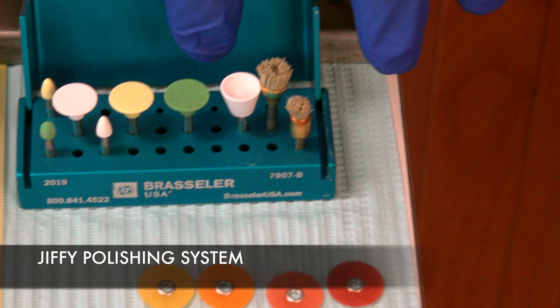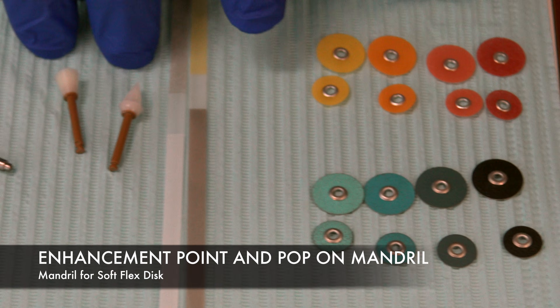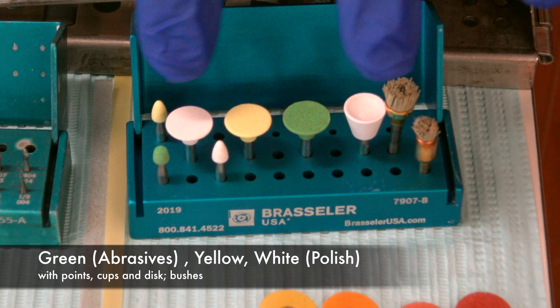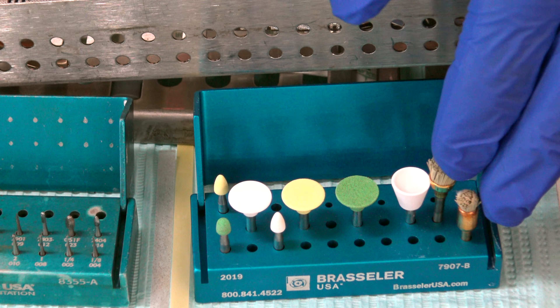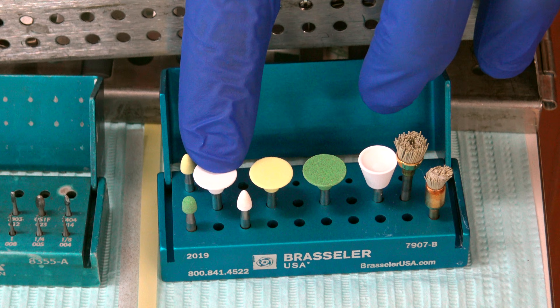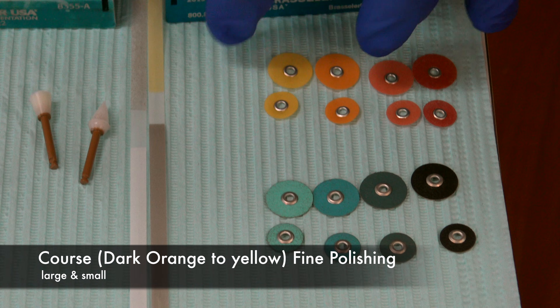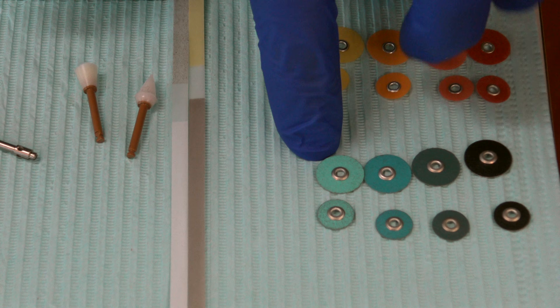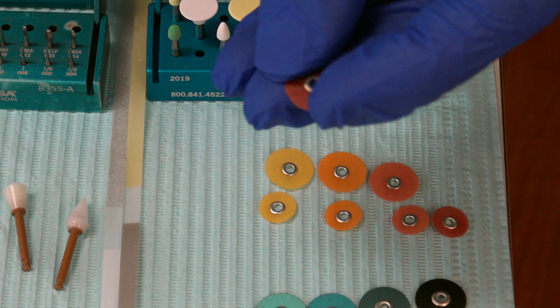We move into our polishing system. This is a Jiffy block, and then our Sof-Lex disc system. We also have sandpaper strips and white cones. The Jiffy system is like sandpaper — it comes in three shapes and three colors: disc, cones, and the diamond brush. The color progression goes from green to yellow to white, and then I like to finish with the diamond-coated brush. In the Sof-Lex system, we go from coarse to fine: dark red, orange, orange-yellow, and yellow, then black to light blue. Keep in mind these have two sides — a shiny white plastic side and a coarse abrasive side.